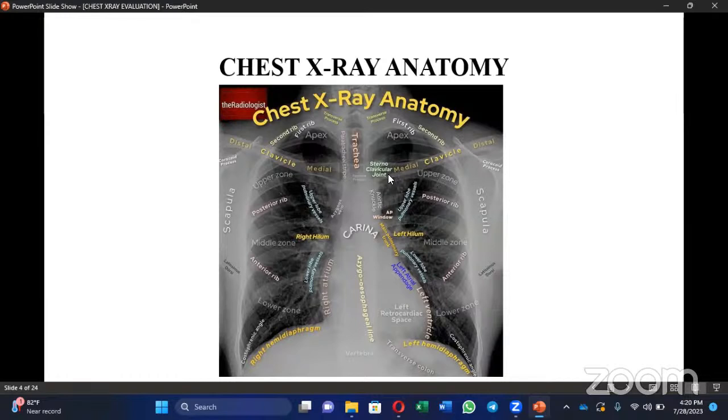Mostly the clavicle helps us to know that yes, this one is the posterior anterior view image or an anterior posterior view image. When you look at the clavicle on the posterior anterior view image, the clavicle looks more or less like an S shape, okay? This one, the image is being cropped, so you can't really appreciate the entire length of the clavicle.